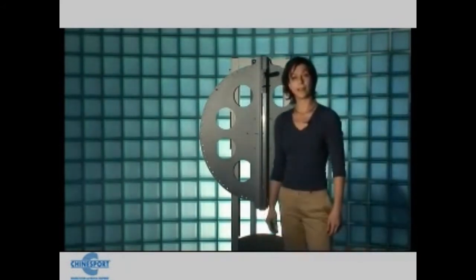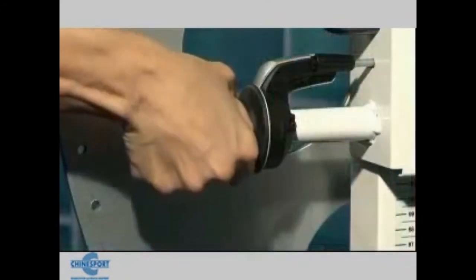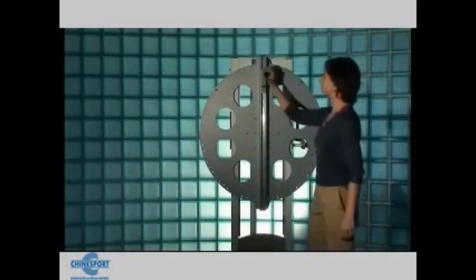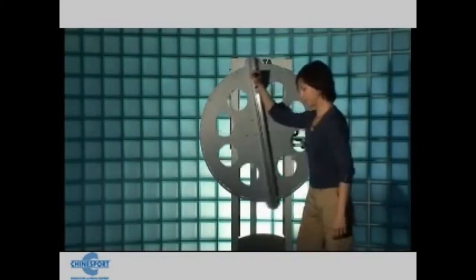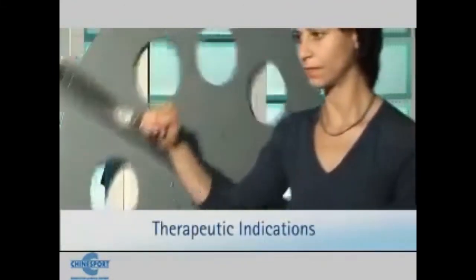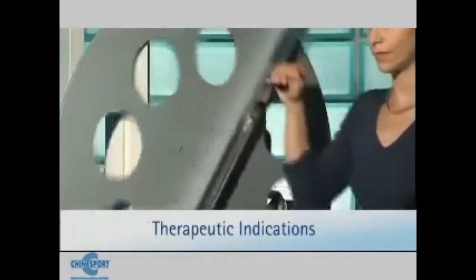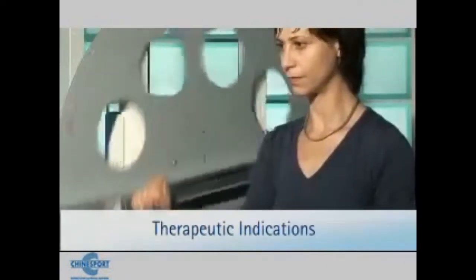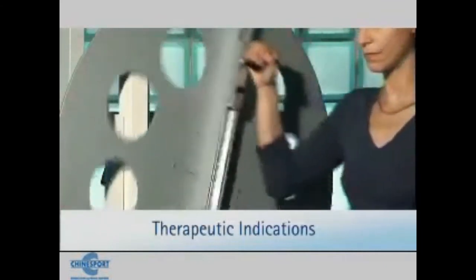Or we can increase the force required by using friction. Therapeutic indications. The exercise is useful when we can leave out the problem of compensations, or because these do not occur, as in non-joint fractures, or because they are unavoidable, and we have to aim for the overall functionality.